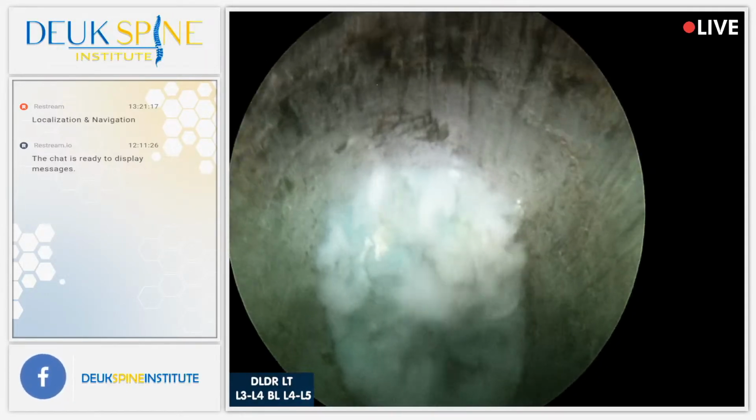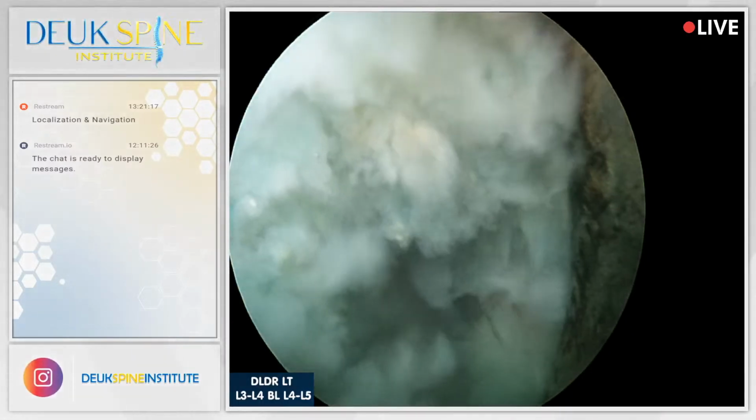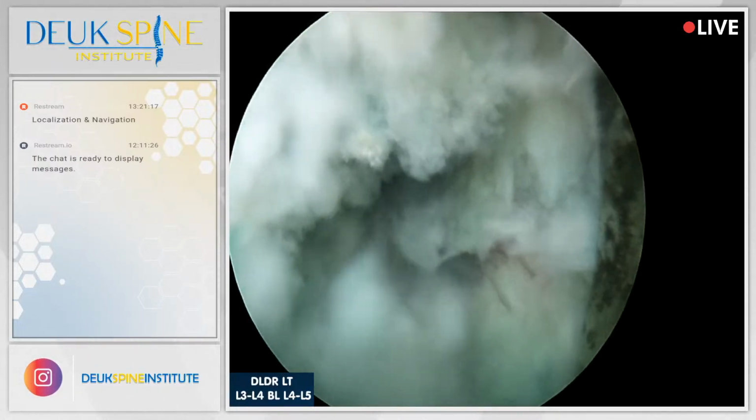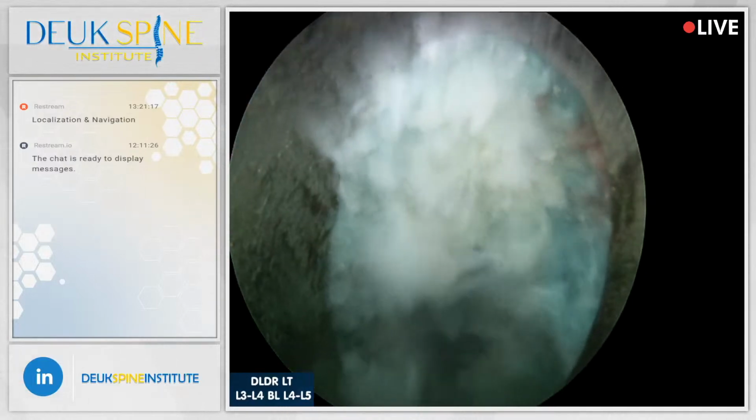All right. As we put this on, it's not all the way down. No. Now it clicked.